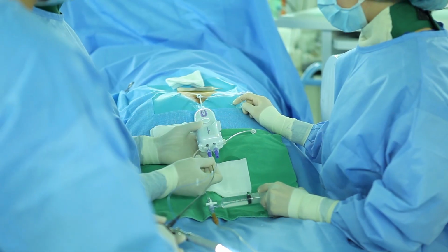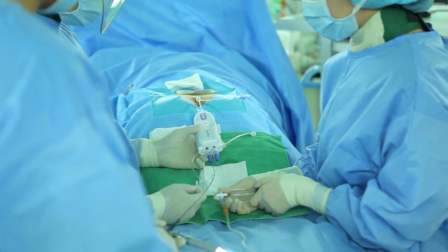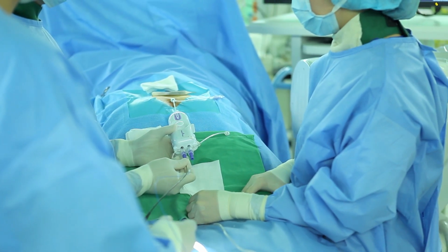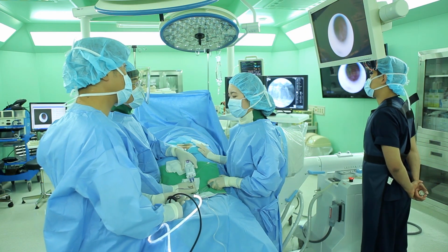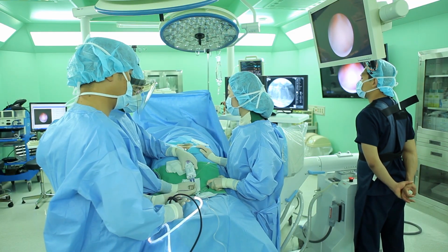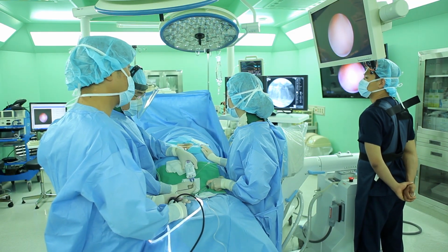You may continue injecting 1 cc of saline by way of pumping, and you will see a clearer view during the 1 cc pumping moment. Now, let's start laser treatment by seeing through the endoscopic cable. It's the key point of this SELD procedure.